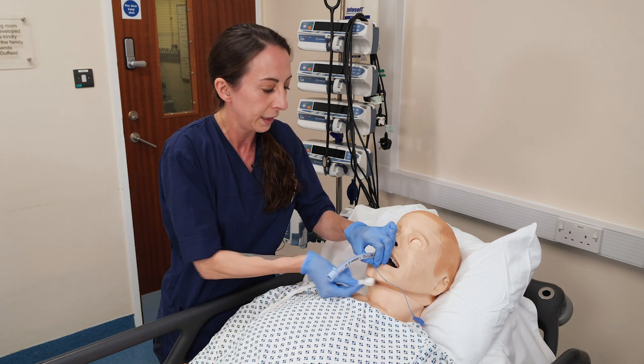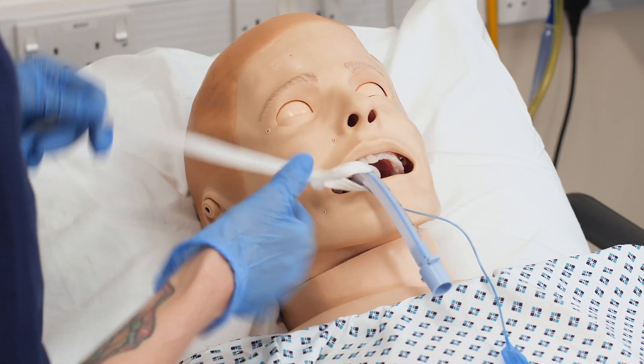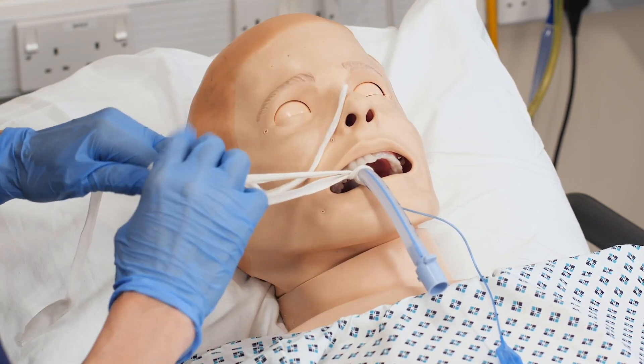So I have my ET ribbon. Pop your ribbon around the tube like so. Pull nice and tight — just one knot is plenty.